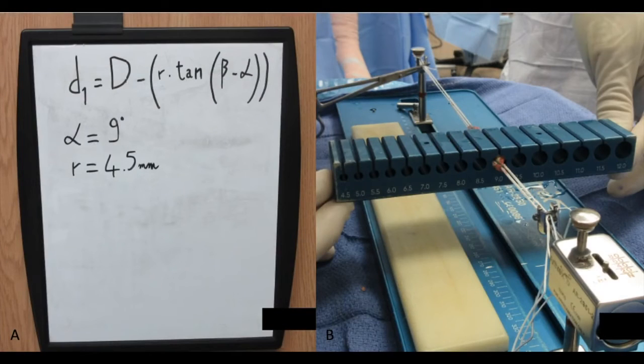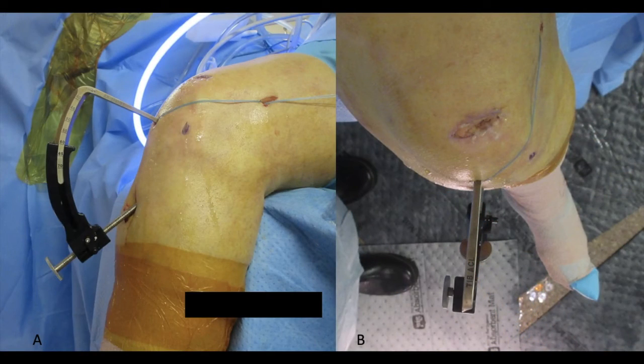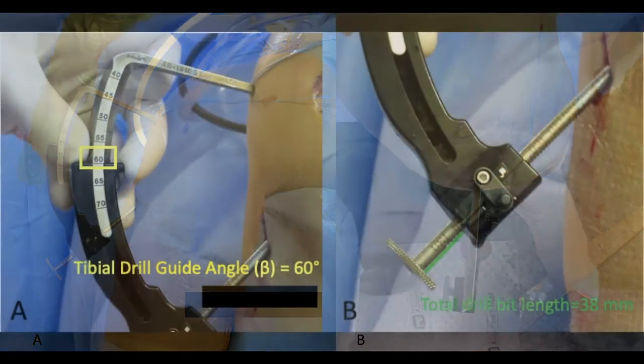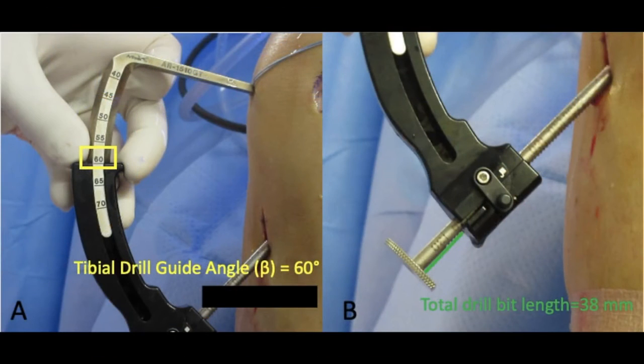We then harvest a soft tissue quadriceps tendon graft, which sizes to 9 millimeters, yielding a radius for our tibial tunnel of 4.5 millimeters. We now position our tibial drill guide parallel with the tibial plateau in the sagittal plane, and perpendicular with the anterior medial cortex of the tibia in the axial plane. We now record our tibial drill guide angle and our drill bit length off of the tibial drill guide.